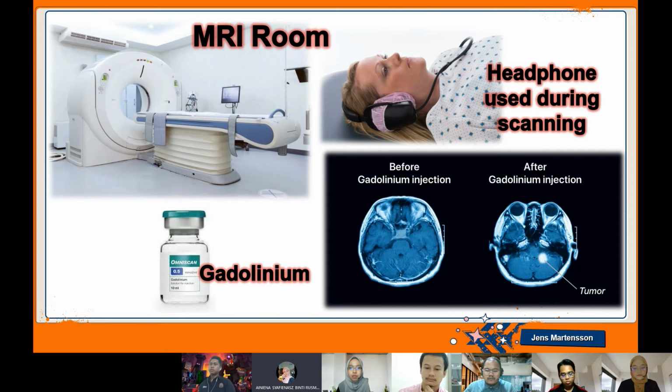Typically, at the beginning of the imaging procedure, a nurse or MRI technologist will place an intravenous line in your arm or hand vein using a small needle. This will allow injection of the gadolinium contrast agent. The line will be connected to a saline solution that will drip through the intravenous line to prevent clotting until the actual contrast agent is injected at some point during the exam.